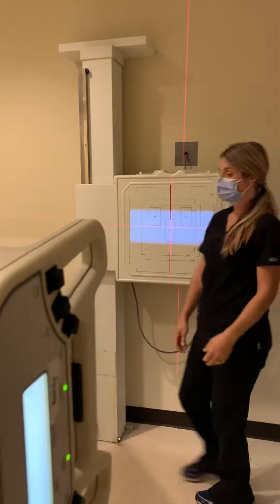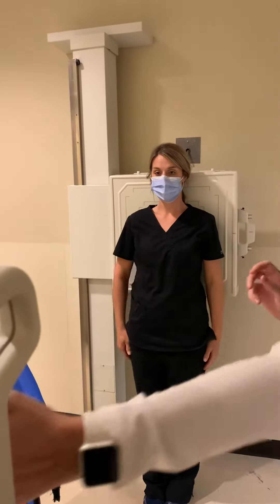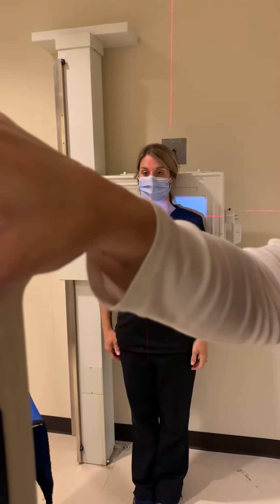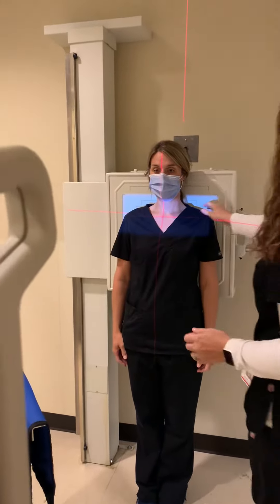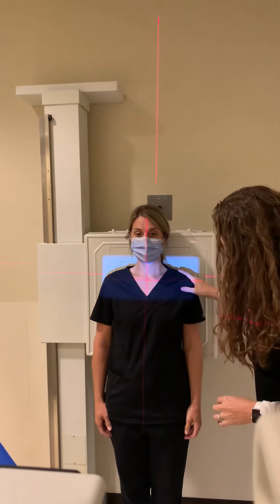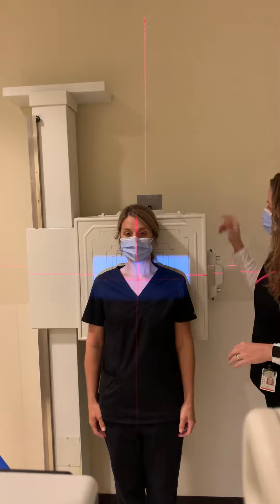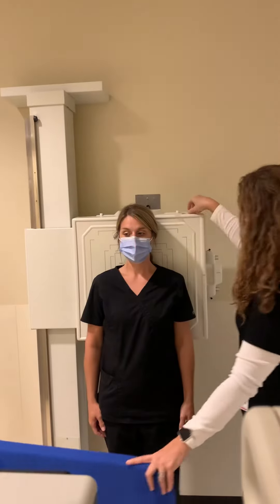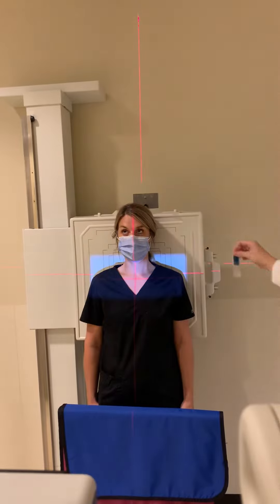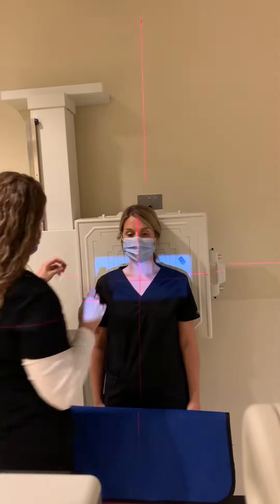We'll bring our patient in, place her back against the board, and we're going to center at the level of the AC joints. We're going to move the image receptor so that it is centered with our tube, and for these you place a marker on both sides — a left marker on the left and a right marker on the right.